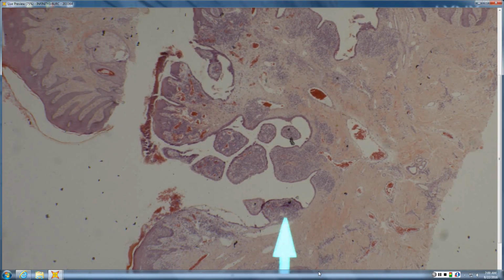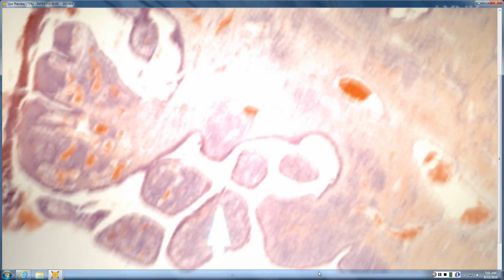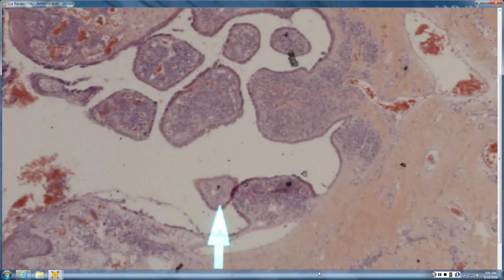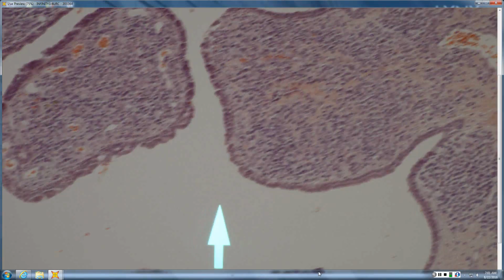And so there's a lot of ways to use the S. All these things start with S and different letters, and they seem to all be very similar. With something like SCAP, when you're comparing it to HPAP, early on we were trying to remember which goes where. With SCAP, you can use that S to your advantage, so it's usually on the scalp. It's usually very cellular. It has lots of plasma cells in it. So within these little proliferations, there's tons of plasma cells in here.